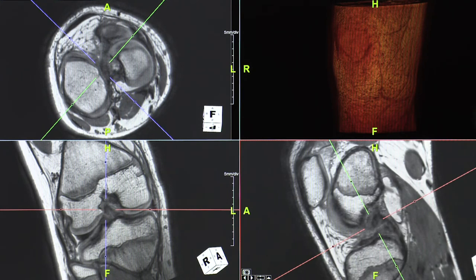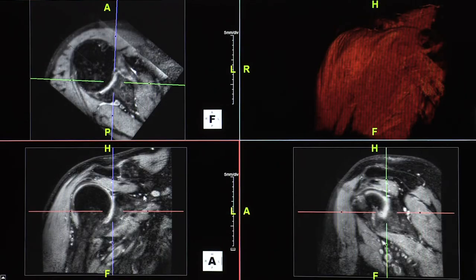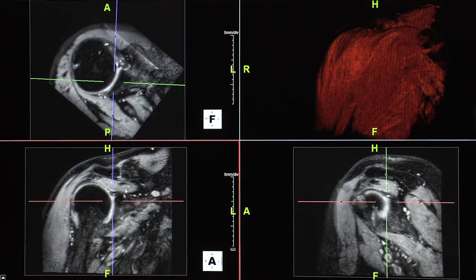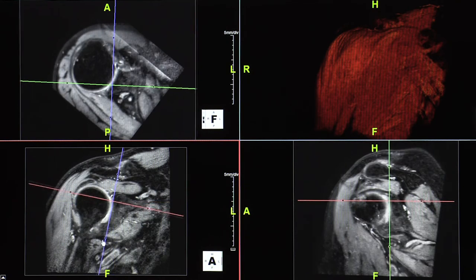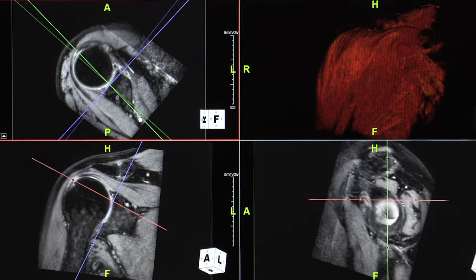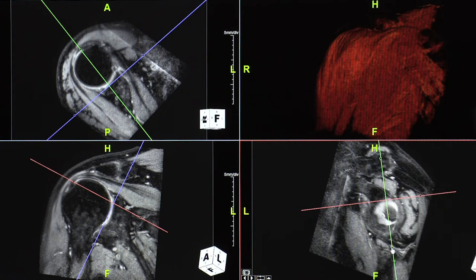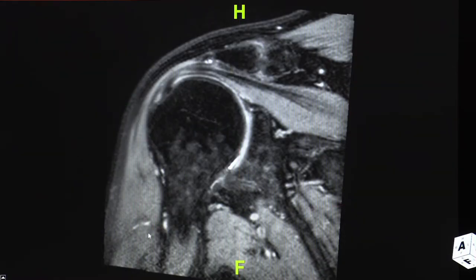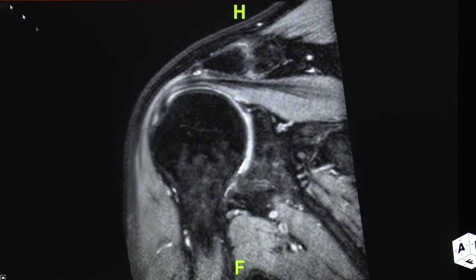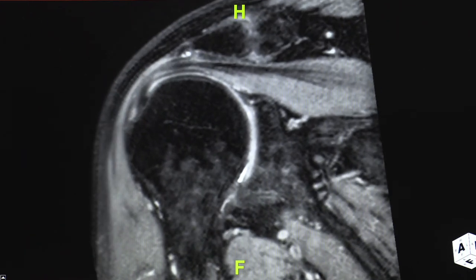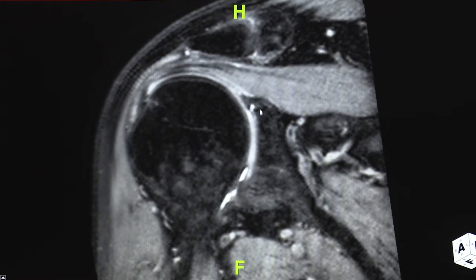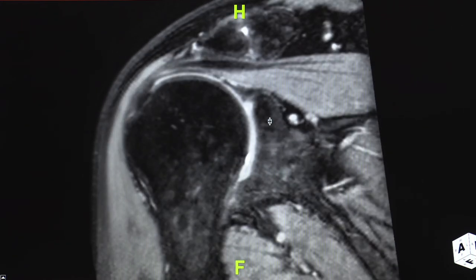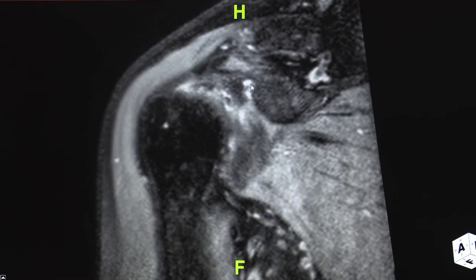Now we'll evaluate the shoulder. The way it's acquired may not be the true axis — the humerus is internally rotated, making it hard to see. So I reorient along the glenoid and scapula. Once oriented in the right plane it's less tech-dependent. You can see the shoulder in the anatomic axis, and you guys can see the labral tear — a big labral tear, nicely seen on 3D with white spots of fluid into the labrum.